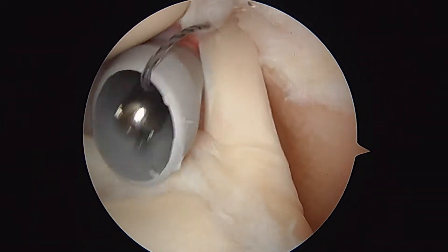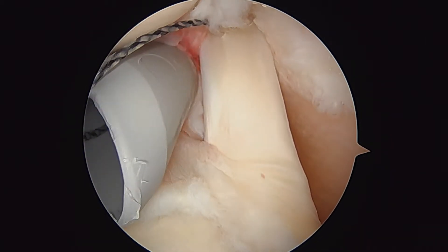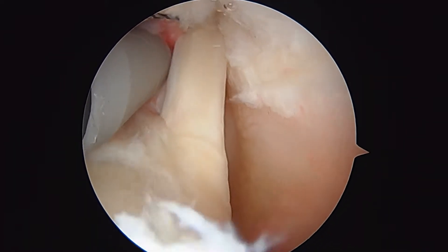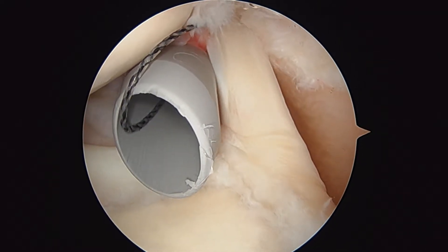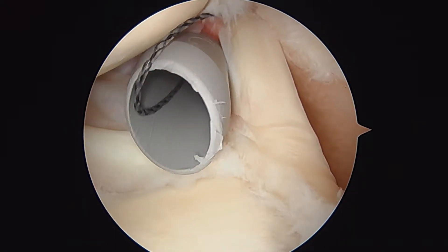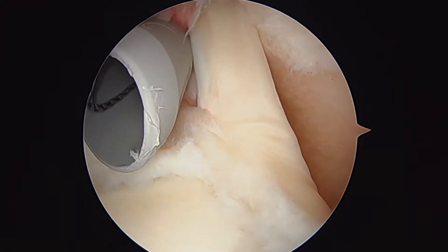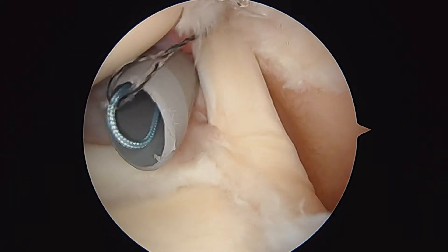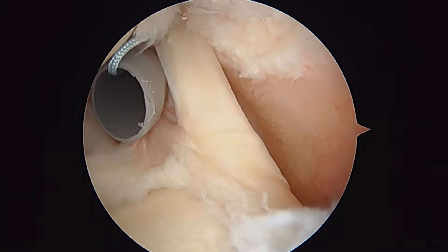We'll go ahead and pull out the relay all the way out. Now we'll take a free suture and load it right here. Outside your shoulder, we're loading a suture through an eyelet — just about an inch of it through. Then we hold tight and pull through. You can see on the screen how that pulls through the biceps right there. Now we're going to do the same thing one more time.